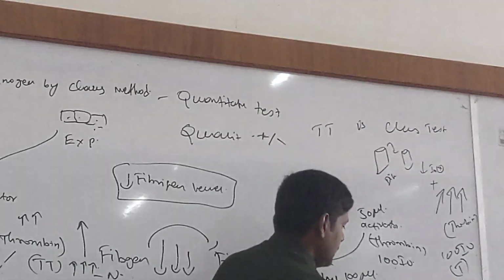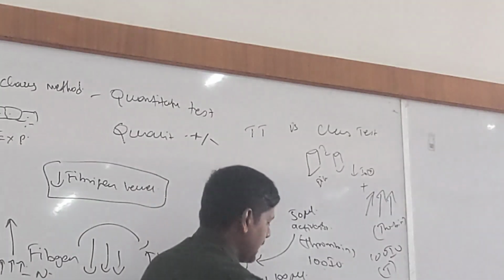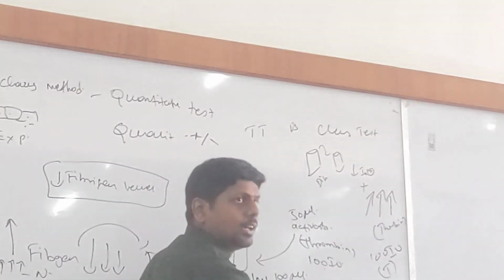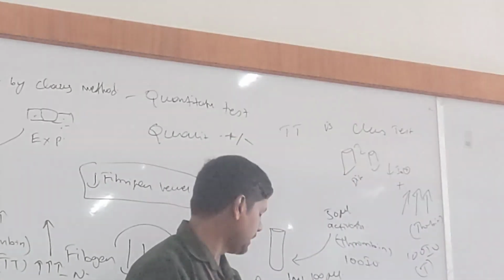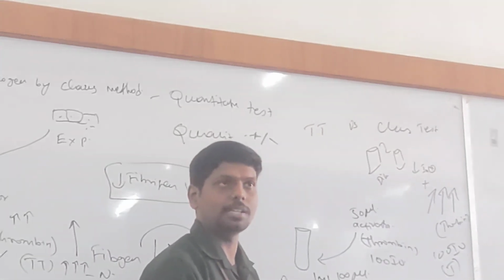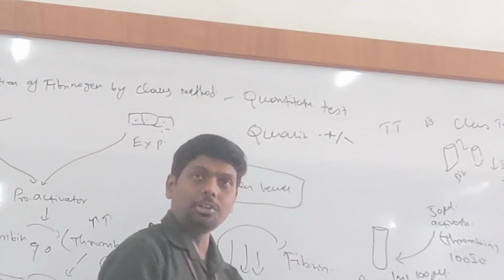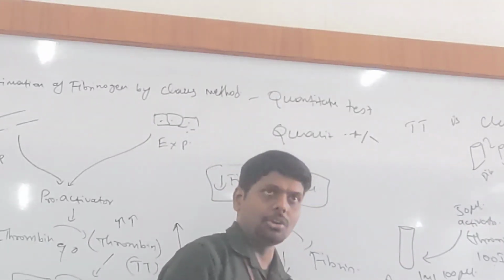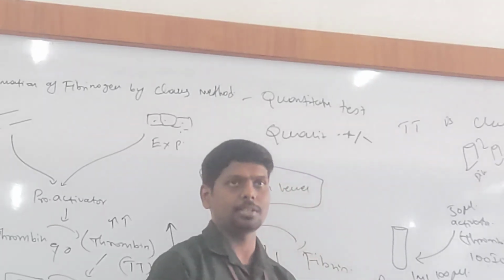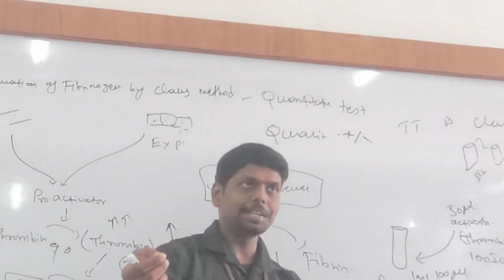So it was a very heavy elevated clotting type. That means there is a heavy clotting in the body. So according to the Claus test levels, we will determine the dosage of anticoagulants. Okay. Now we are giving anticoagulant and I need to measure my anticoagulant therapy in the patient, whether my anticoagulant is working in the patient or not. Got it? Before treatment, I conducted a test.